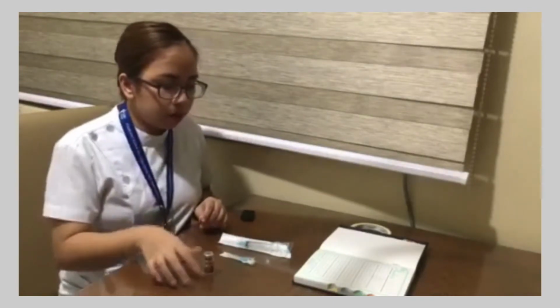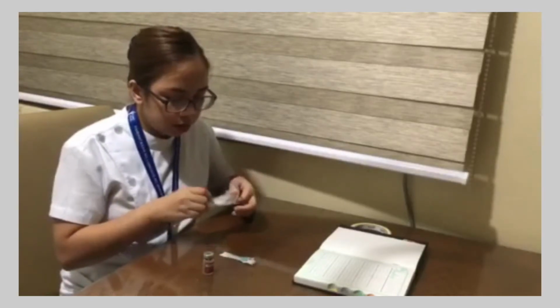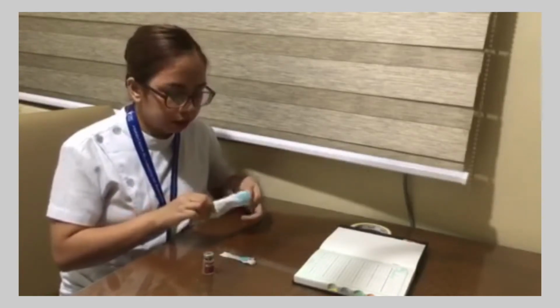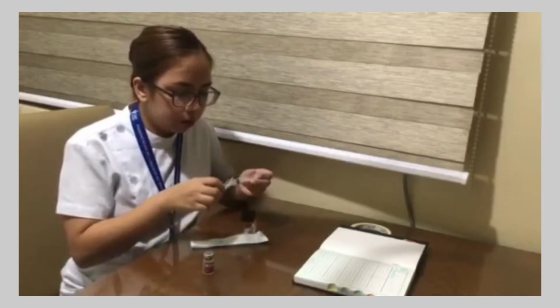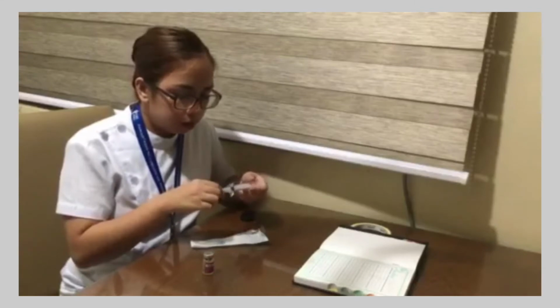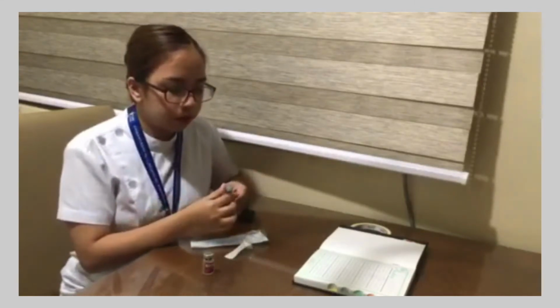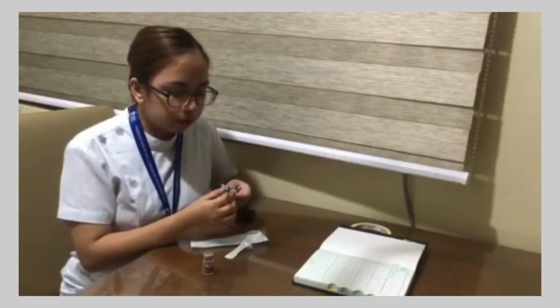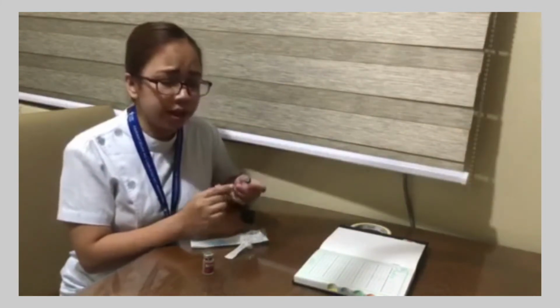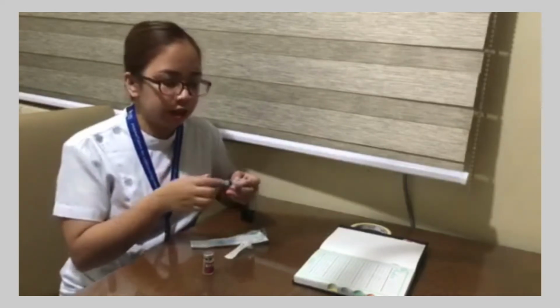Next, I'm going to attach the syringe to the filter needle. This is to remove the solid particles that might be withdrawn with the medication. Ensure that the filter needle is firmly attached to the syringe.